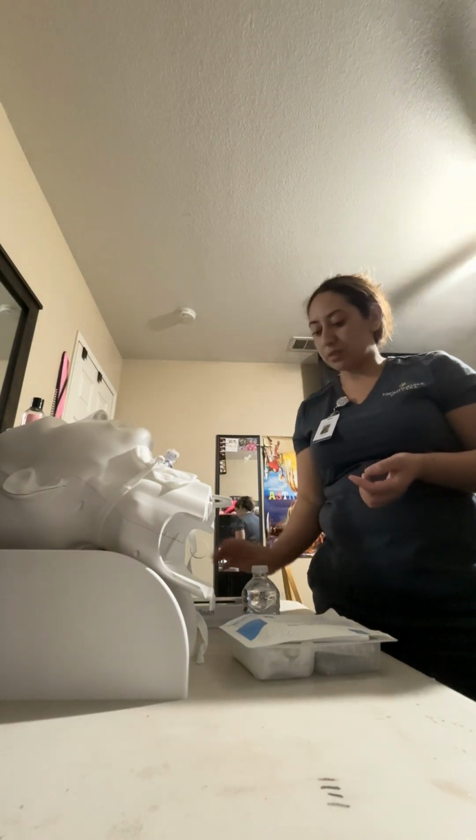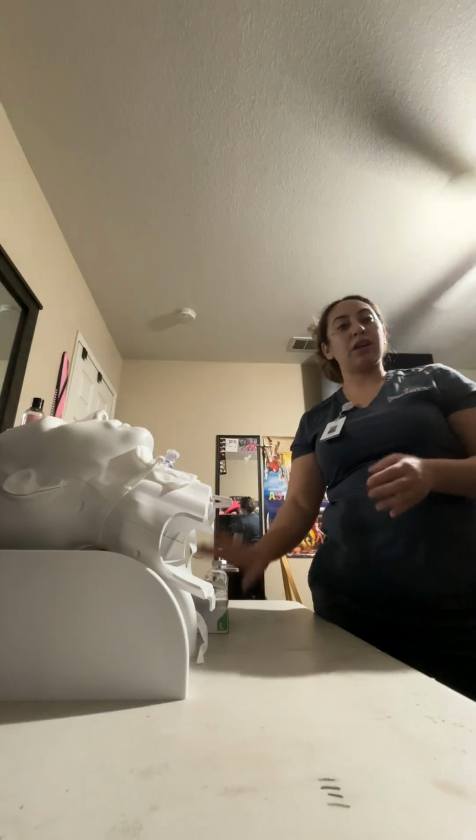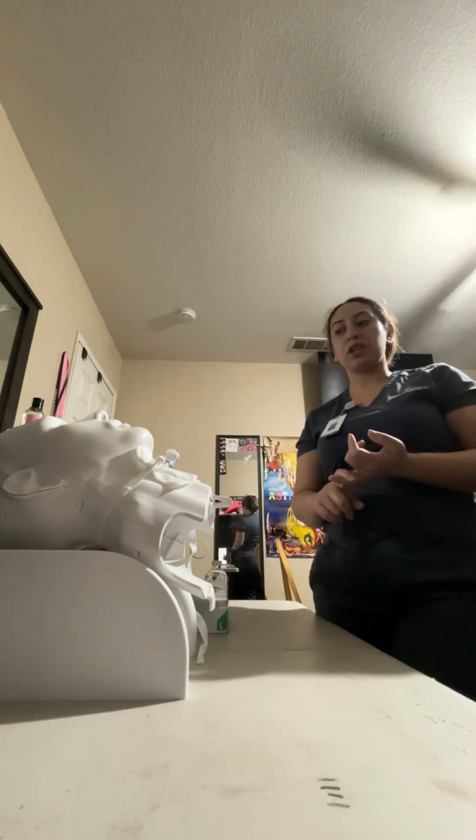For tracheostomy care, I'm going to first obtain doctor's orders. I'm going to read over those and verify that the information is correct. I'm going to go to the patient and identify myself. I'm going to have the patient verify their name, their date of birth for me. I'm also going to check their wristband to assure that this is the correct patient.